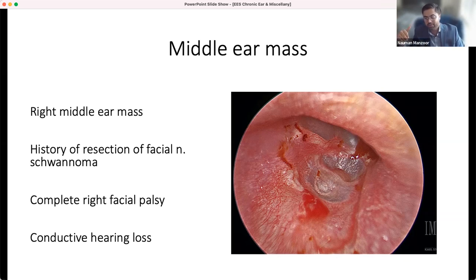So I started doing that in some cases. And so exactly the case you showed, it makes it very easy. The only point is that there are some other surgeons who would frown upon this idea. They're like, this is not good. But if our goal is to have a completely repaired eardrum and hearing improvement, then in my hand, sometimes I would do that too, just because it makes it so much easier and you don't have to elevate in more areas.